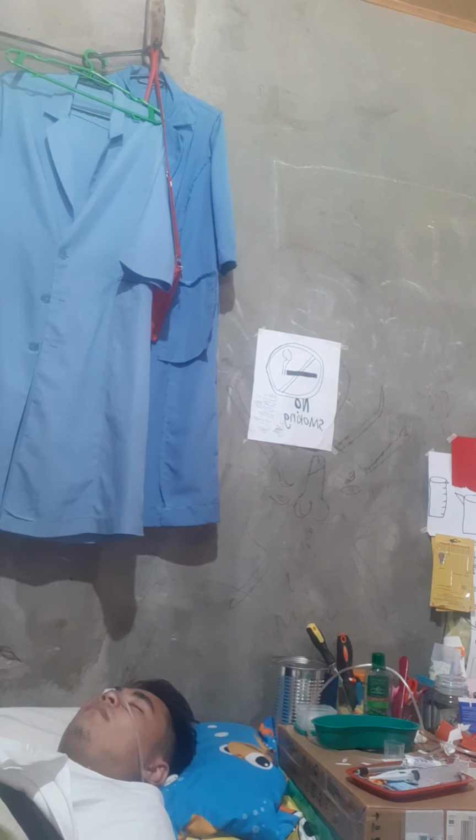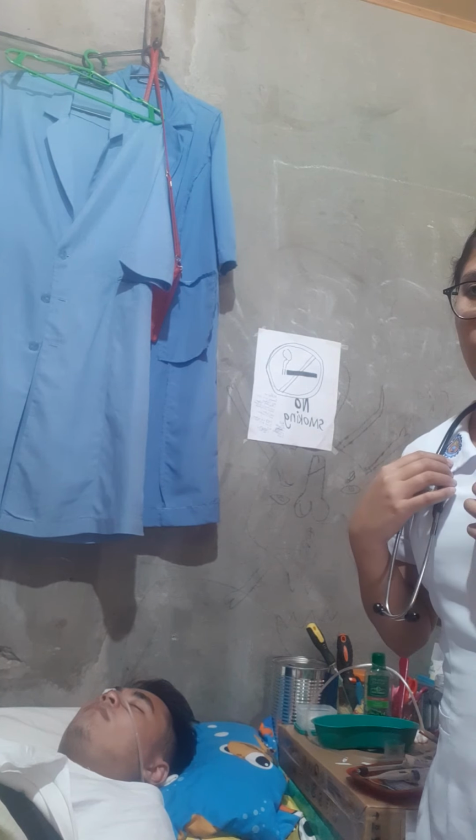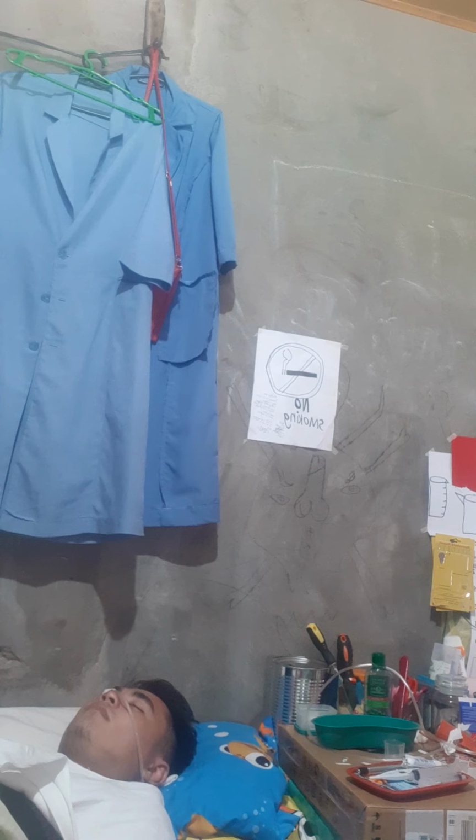Next, assess residual feeding contents. We are going to aspirate all contents and measure the amount before administering the feeding, because we need to first evaluate the absorption of the last feeding, whether undigested feeding from the previous one remains. If the tube is in the small intestine, residual content cannot be aspirated.